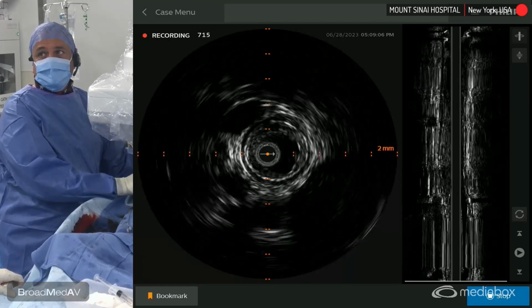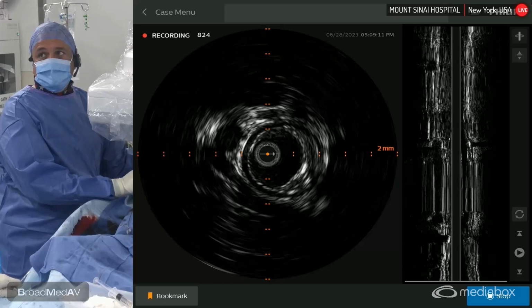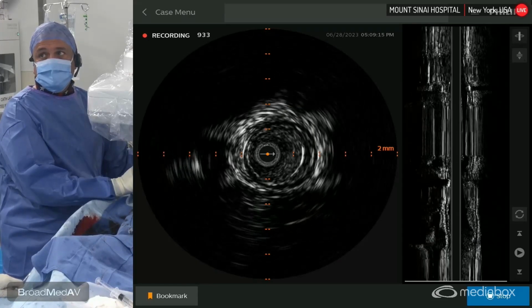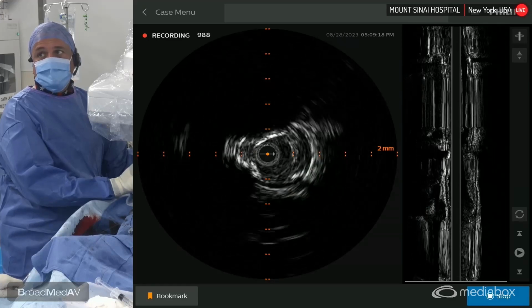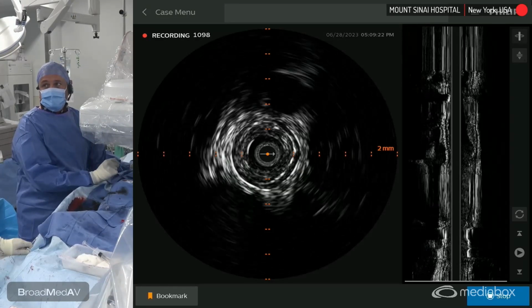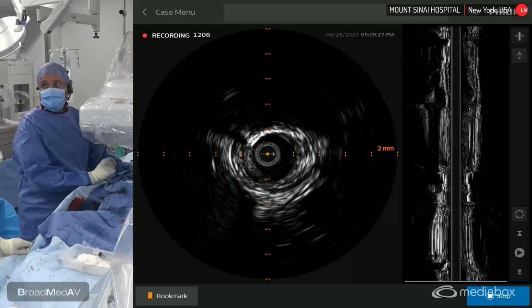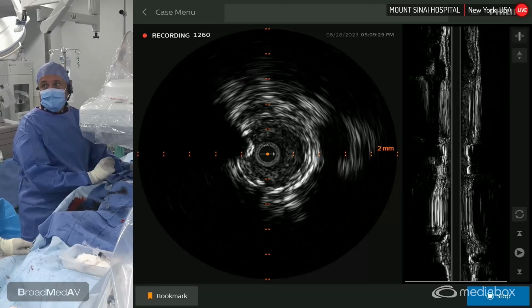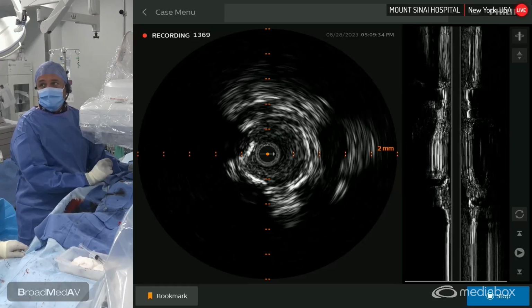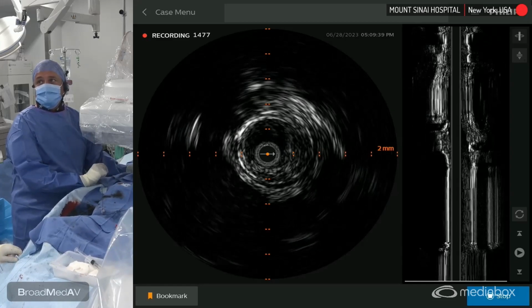And as I pull back, you'll see again a calcified lesion, very tight. And then really pretty clean up until you get to the proximal. There's some floating debris, likely thrombus at this area, and very tight in that area, likely thrombus again. Very speckled in appearance. This is fibrocalcific plaque. Okay, and then you have fibrocalcific plaque mixed with thrombus. See that speckle and see how it's moving with the vessel? So that's layered thrombus for sure. And that's part of the reason why the embolization occurs.